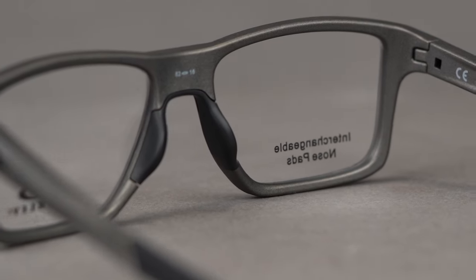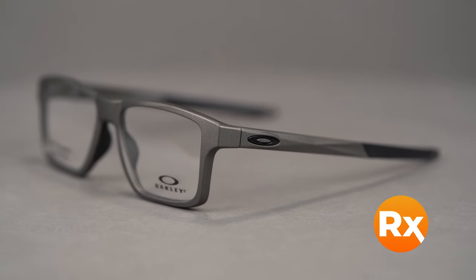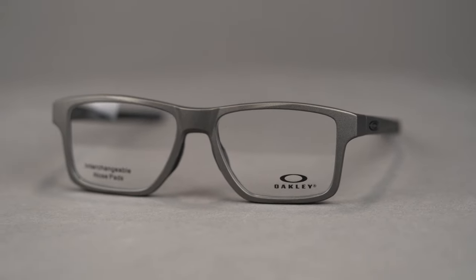The Chamfer Squared comes in a variety of colors and holds a range of prescriptions, including progressives. You can even get it with Oakley authentic digital lenses, or you can build your own custom lenses from the SportRx options.